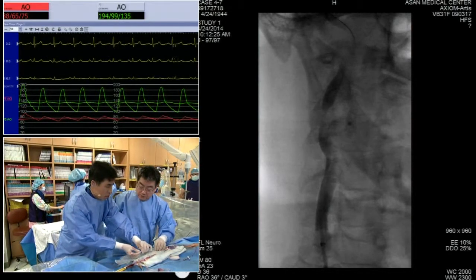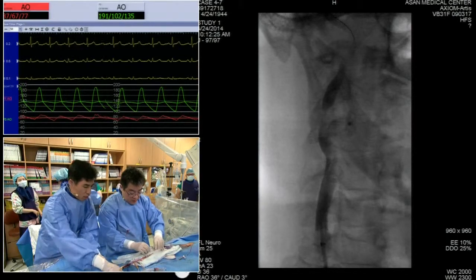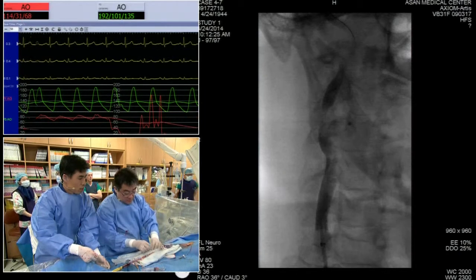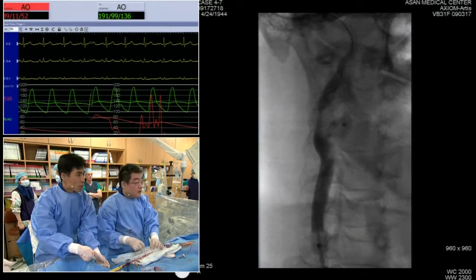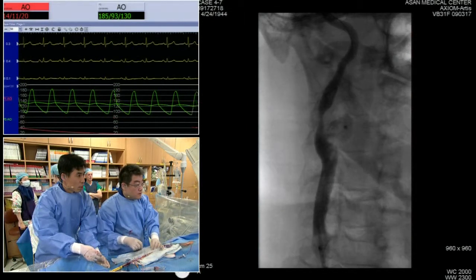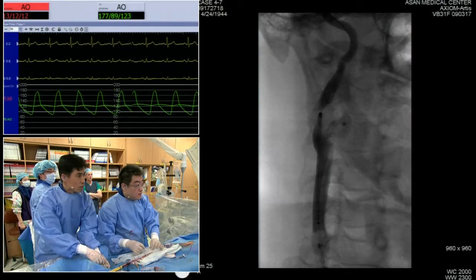What type of anticoagulation are you using? Is this heparin or? Just heparin, 6,000 units, given according to the body weight of the patient. Any thoughts from the panel or from you, doctor, about bivalirudin for carotid artery stenting? Any benefits or just increased cost? We just use heparin.